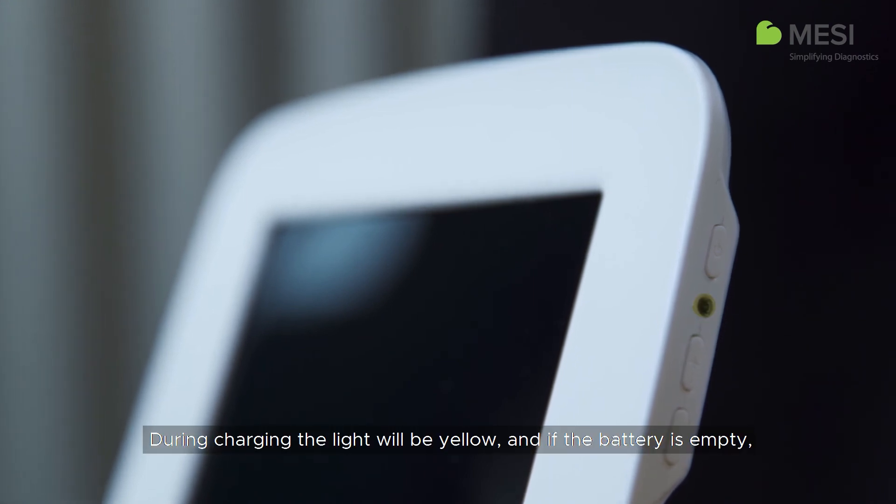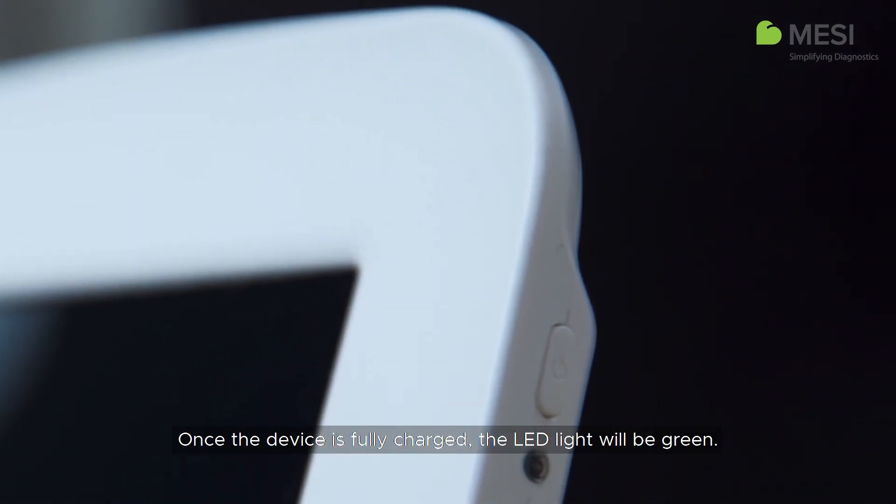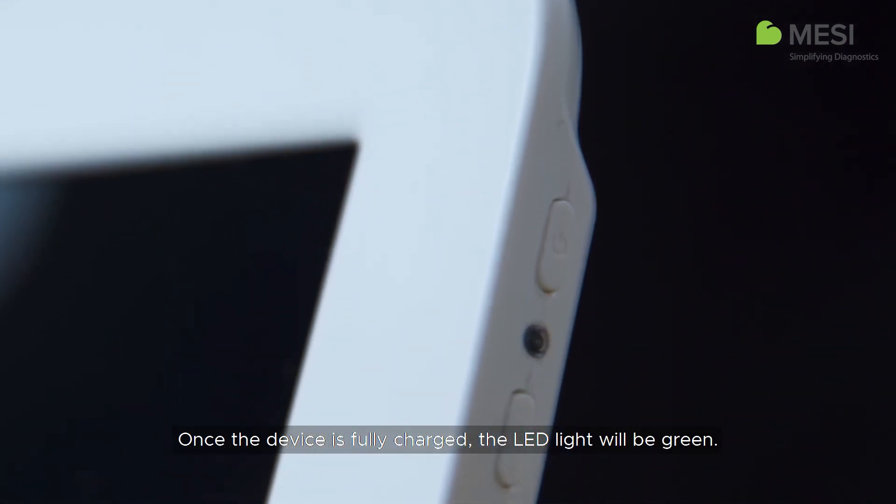During charging, the light will be yellow, and if the battery is empty, the light will turn red. Once the device is fully charged, the LED light will be green.